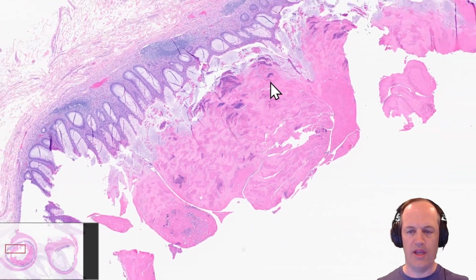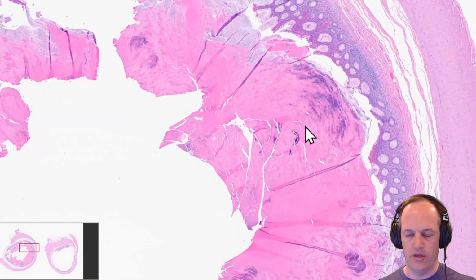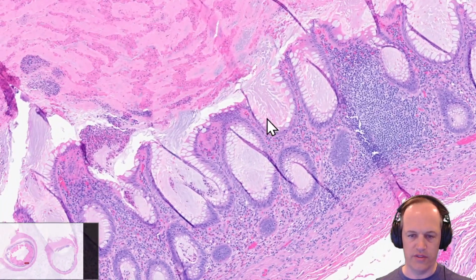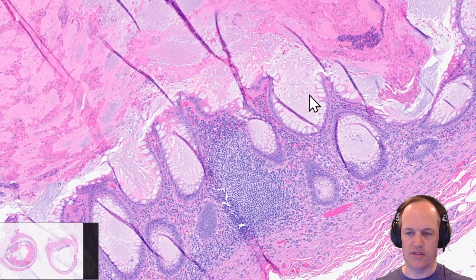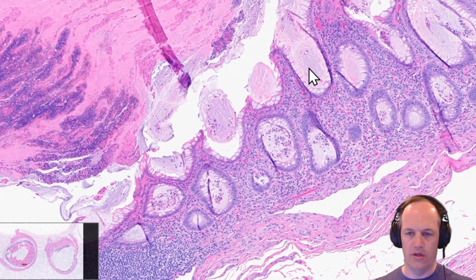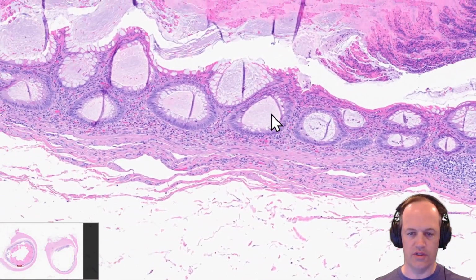So they may have pain and symptoms because their appendix is dilated by this mass of very thick mucus. But usually these patients are clinically known to have cystic fibrosis, but this is a very, very typical appearance. You can even see this in mucosal biopsies, this thick mucus that just seems to be streaming out of these pits, of these crypts in the mucosa.